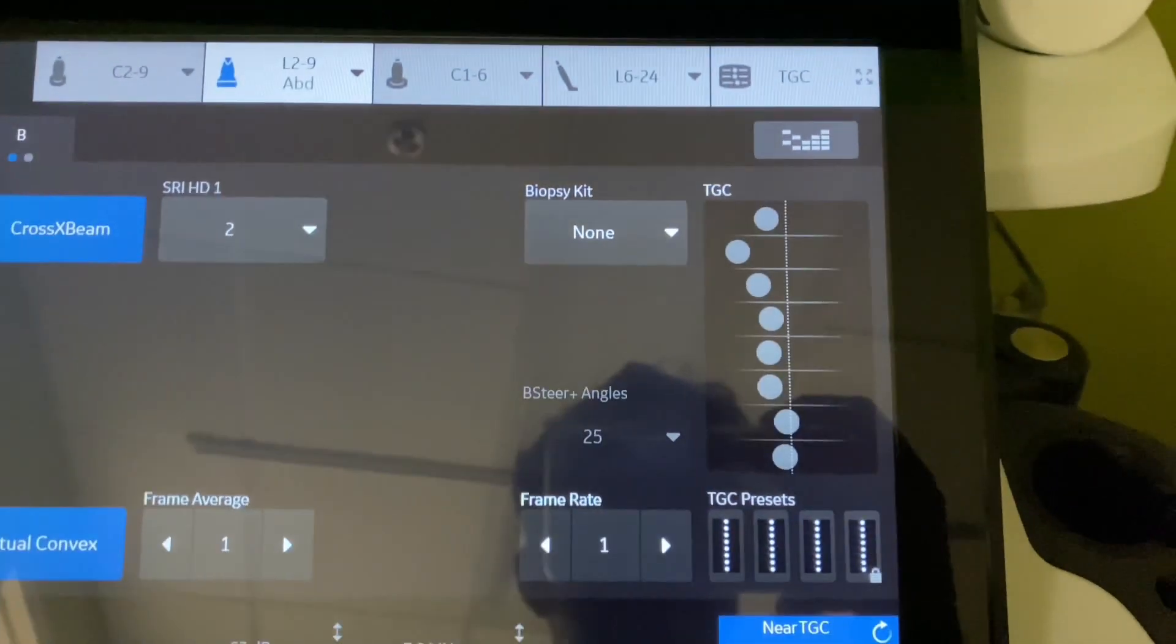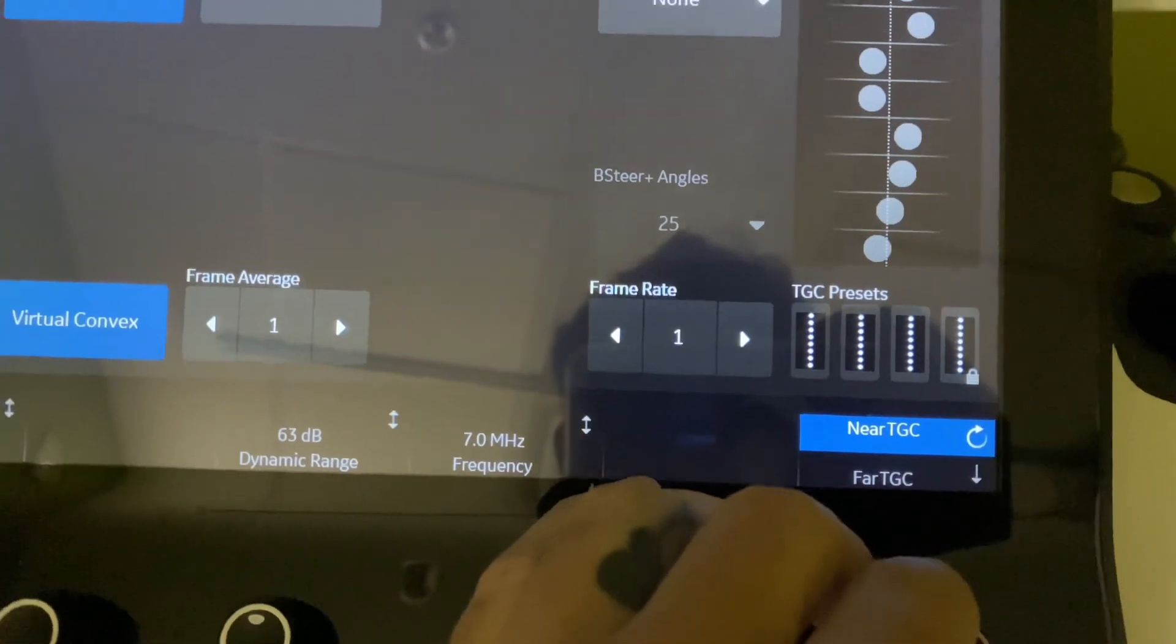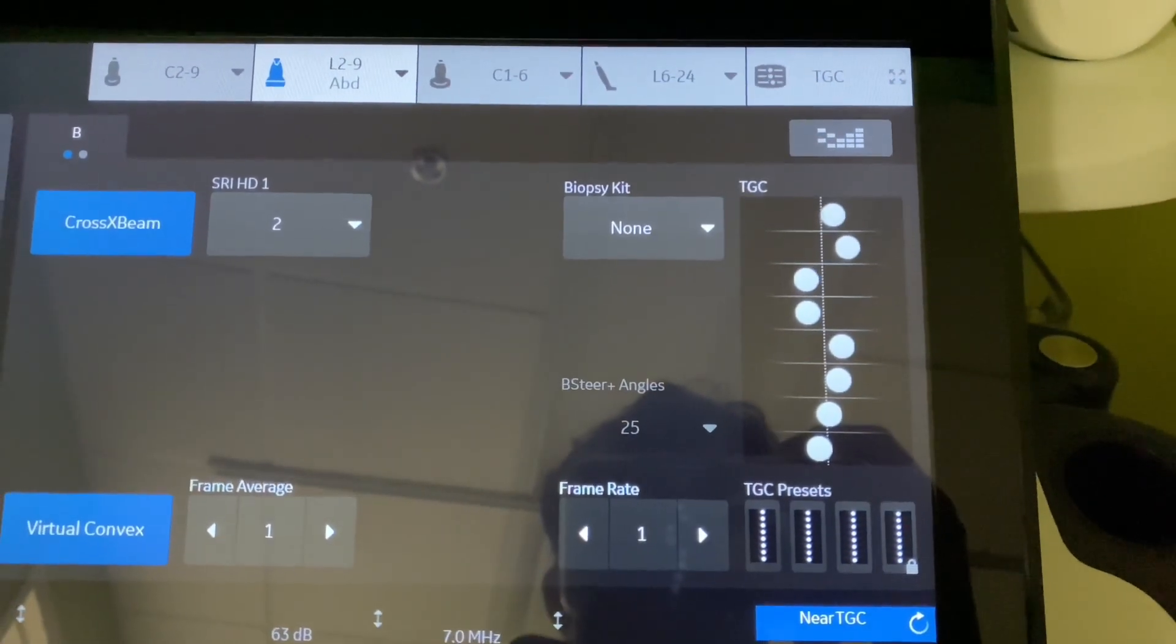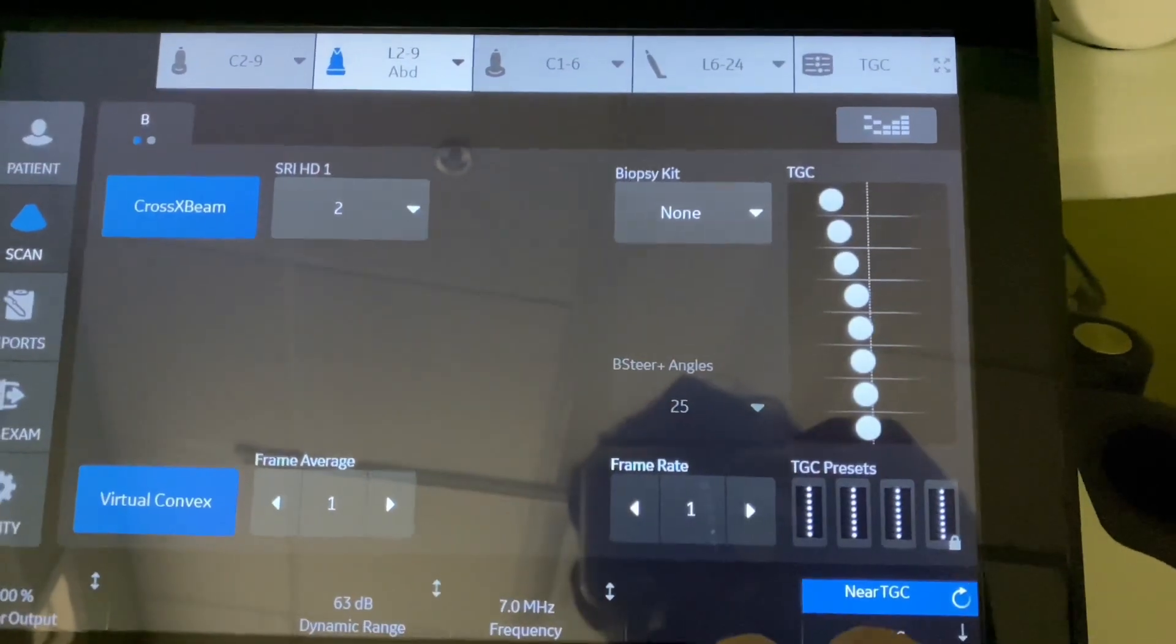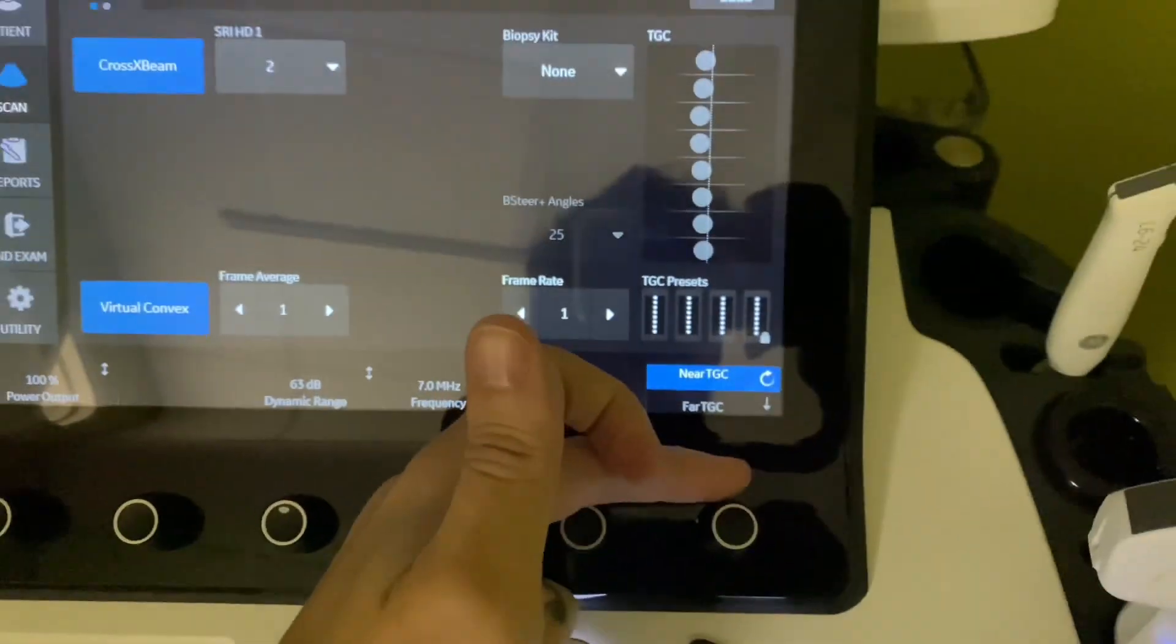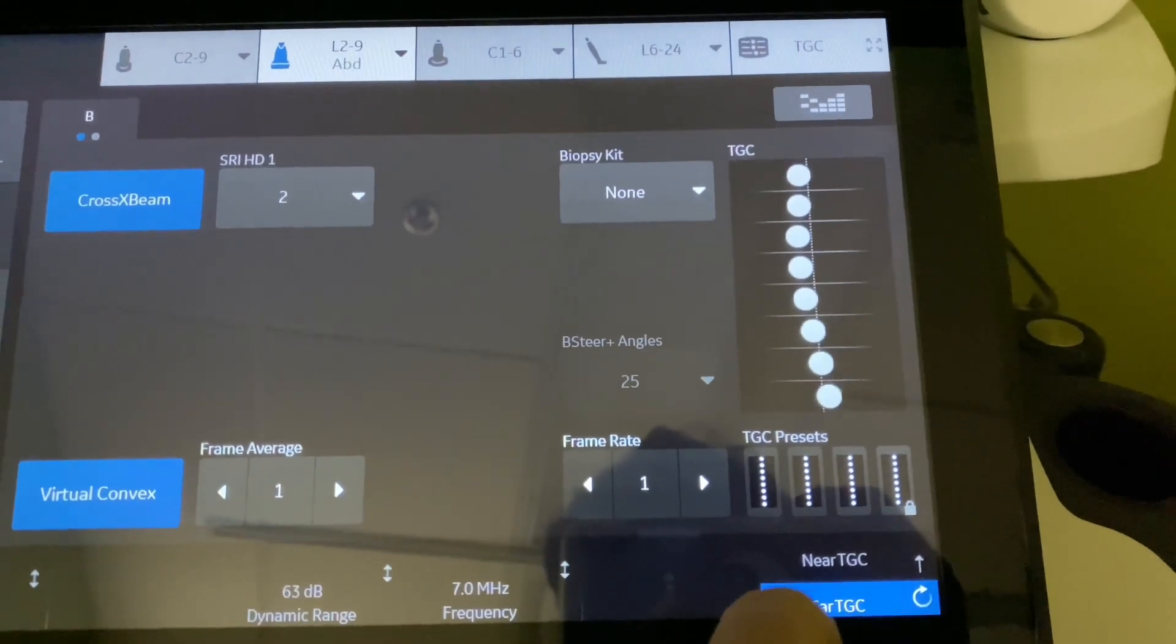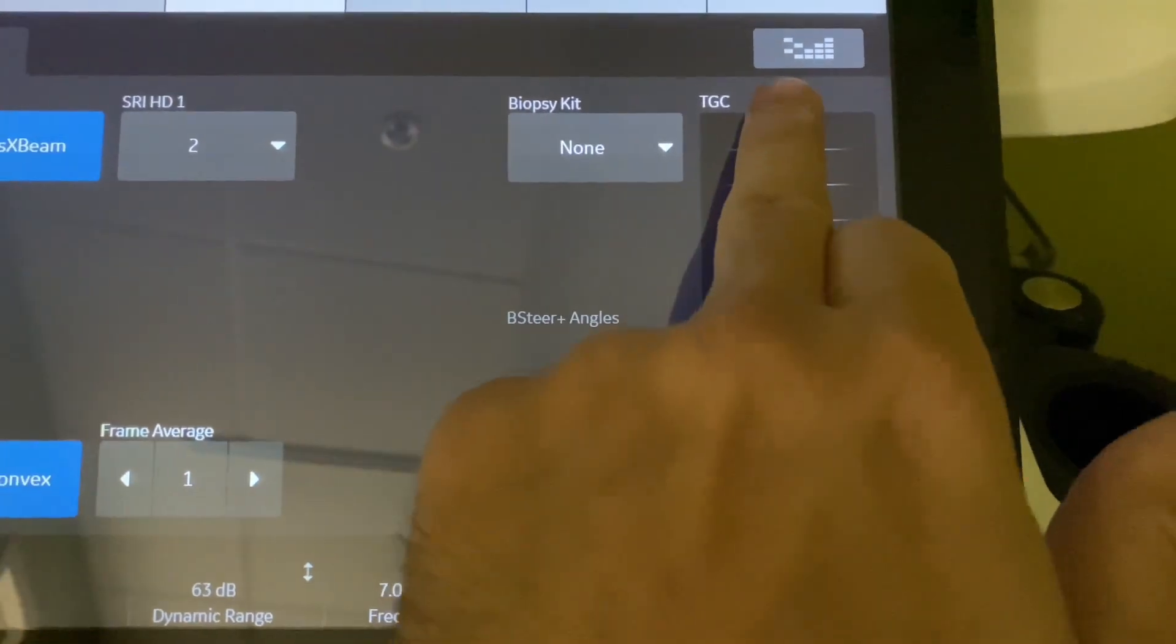All right, so I redact my statement. That's fine. But there's also this right here. So near TGCs would be these and you can kind of just scroll them, so if they're like set in a line, you can kind of do like a nice little curve. And then far TGCs, click down, and it's the same thing.